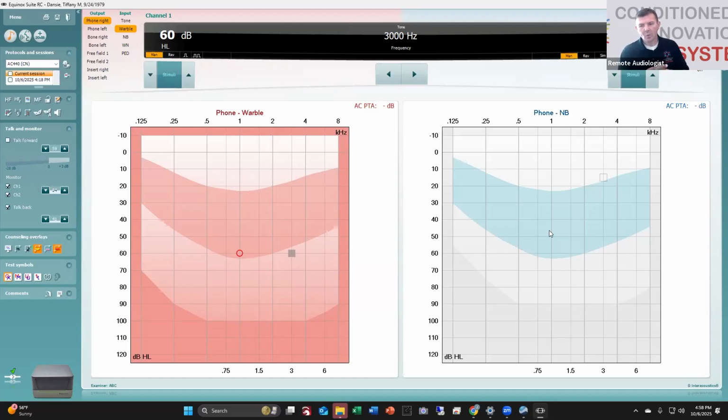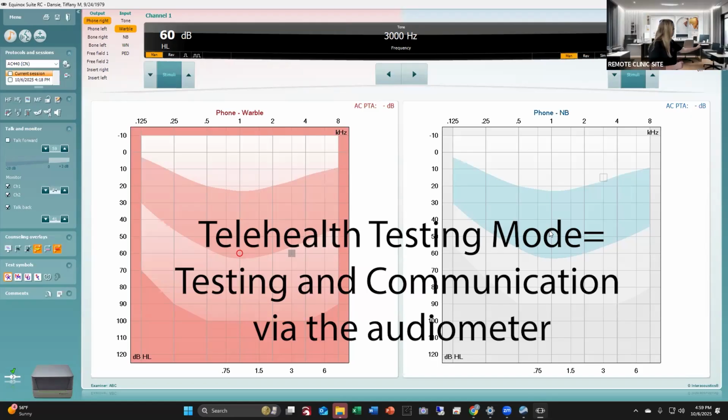All right, Tiffany, we're going to begin testing. I'm going to have you flip the switch on your left there on the Telehealth Audio Interface from counseling to testing mode, okay? And at the same time, you're going to put on some headphones over your ears. Okay, I'll do that now.